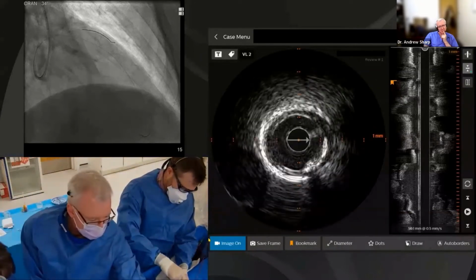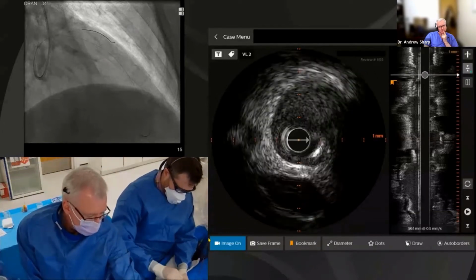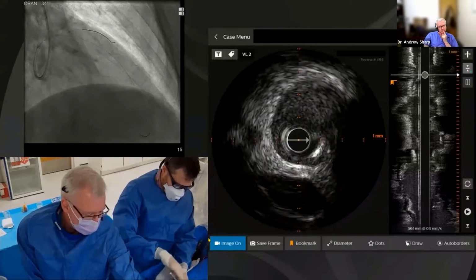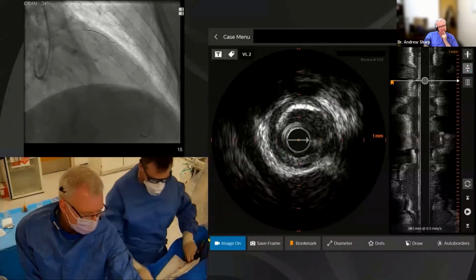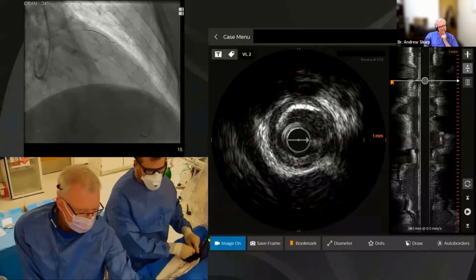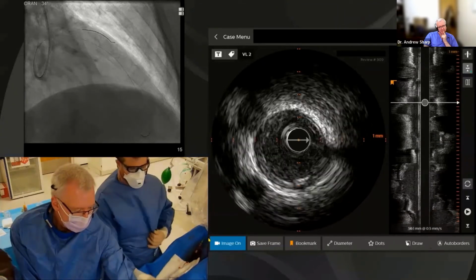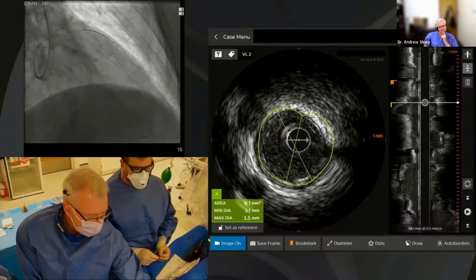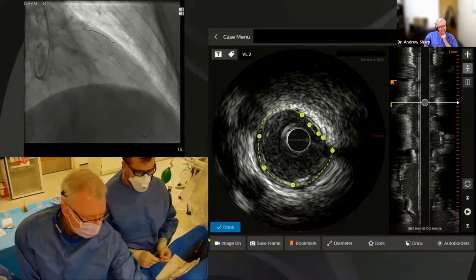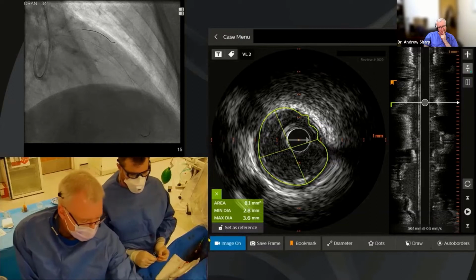Sorry. So I'll just have a look at this IVUS run there. There's our distal vessel again, which had a single arc of calcium. Here is what we're calling an ectatic segment, but it's actually a healthy segment. And then we come back in, and that was where we had that lesion. And you can see how much more we're seeing now. It's nicely released. And then as we come back to this segment here, which will be within the body of the stent, we're at 3.25 there as an average.